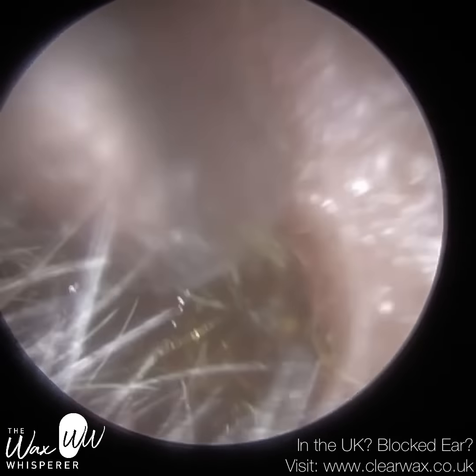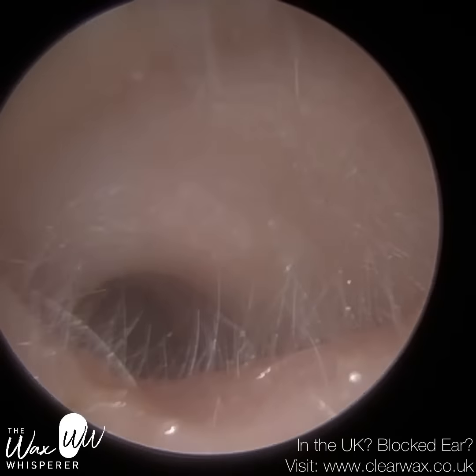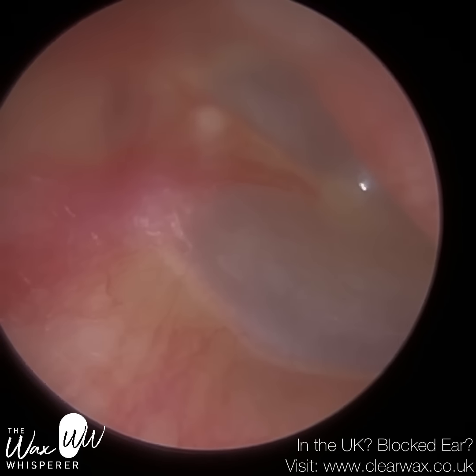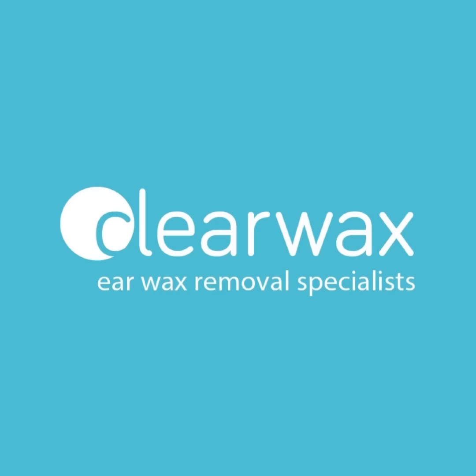Now, if you remember before, I mentioned the front part of the ear canal. We're going to go back in. You'll see the protrusion to the right-hand side. It really comes forward. You may see it on the right there. And then the eardrum is almost hidden, the front part behind that. And so was the wax. The wax was trapped there, which made it difficult to remove. So there are all the wax plugs. They look like little pellets, some darker than others. So the darker bits are the wax that's been there for longer. They're very round in shape.